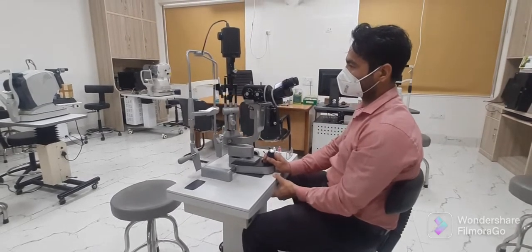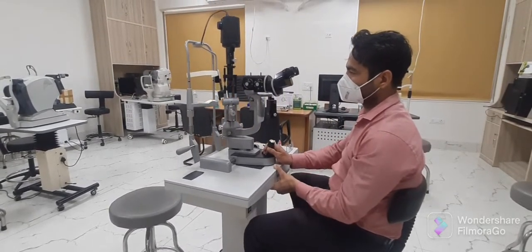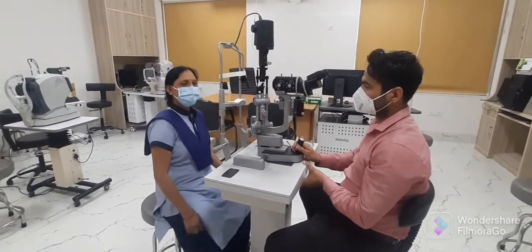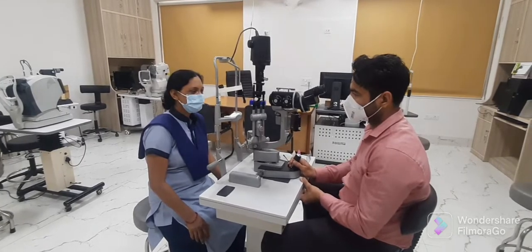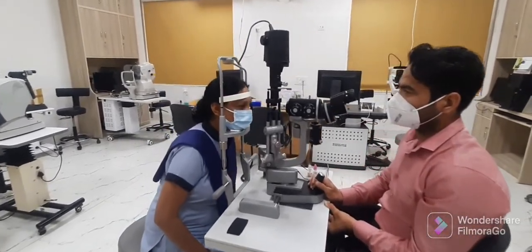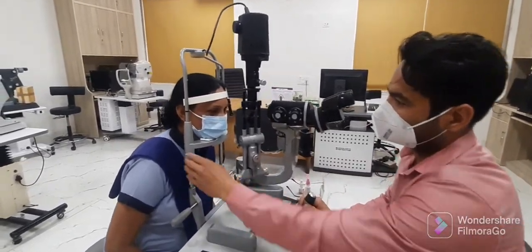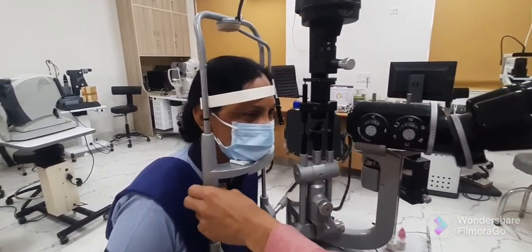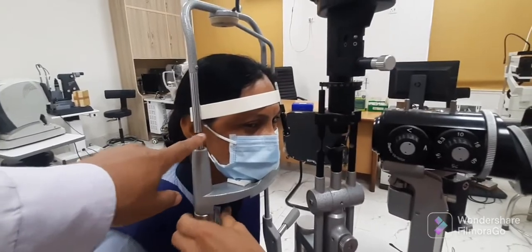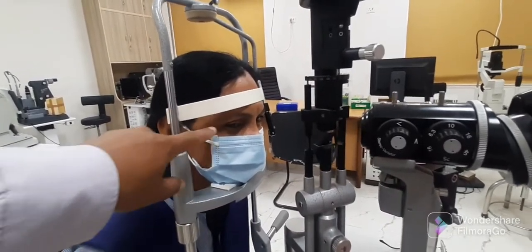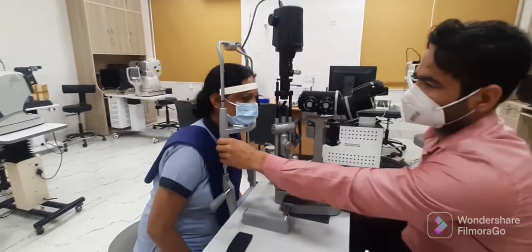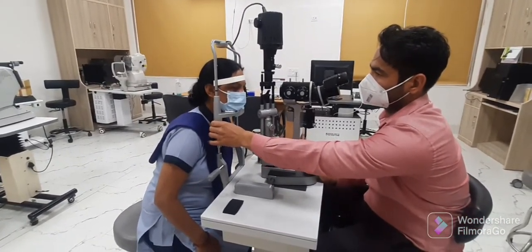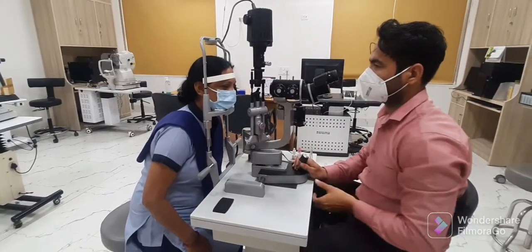The next most important step is to adjust the height of slit lamp according to the sitting position of the patient. The height of slit lamp will be adjusted according to the patient, and the patient is rested on the chin rest and headrest. Adjust the knob so that this black mark should align to the temporal canthus of the eyeball, and this is the proper positioning of the patient on the slit lamp.